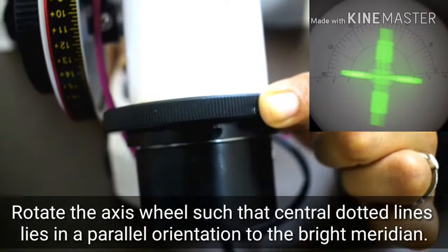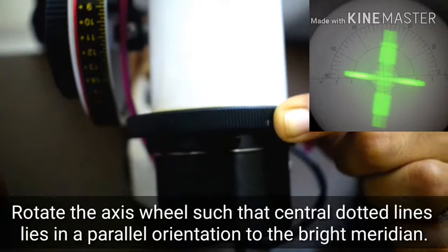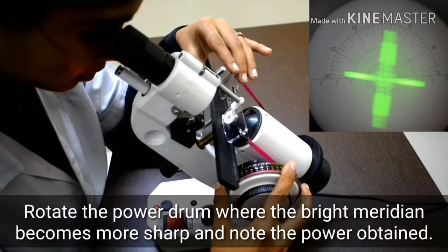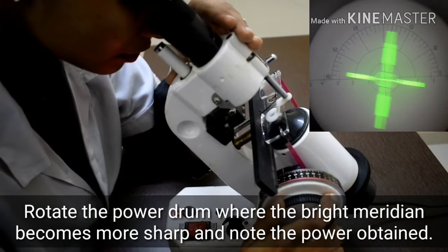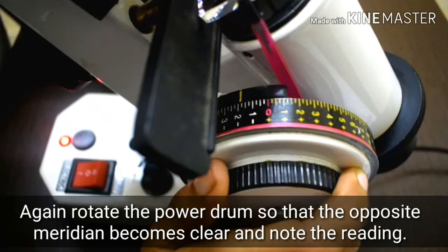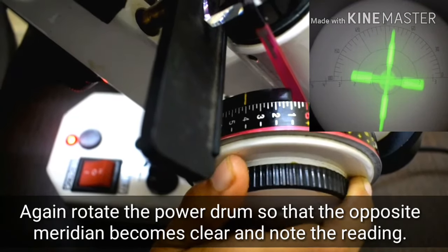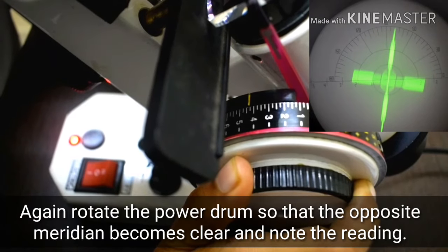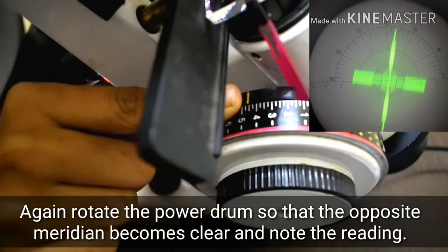Rotate the axis wheel such that the center dotted line lies in parallel orientation to the bright meridian. Rotate the power drum where the bright meridian becomes more sharp and note the power obtained. Again rotate the power drum so that the opposite meridian becomes clear, and note the reading.